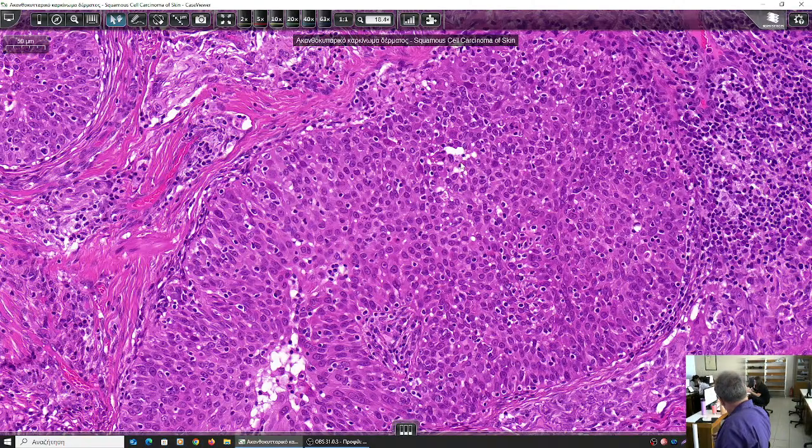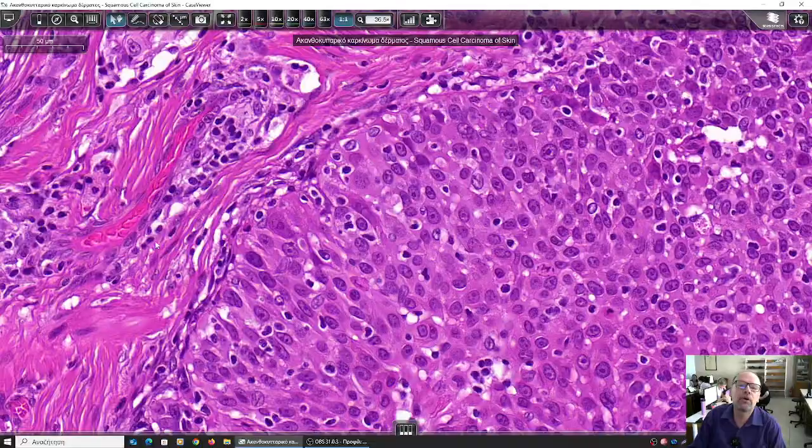What are the signs that we should look for histologically for the squamous cell? For the squamous cells: pink cytoplasm. In the specific tumor, pink cytoplasm of malignant cells, dyskeratotic cells, and intercellular bridges. In this slide, these three features define squamous cell differentiation. It is not so well differentiated to see keratin pearls. It is of intermediate differentiation. And here is invasion, irregular projections in the stroma. You see how irregular they are? So it appears invasive.